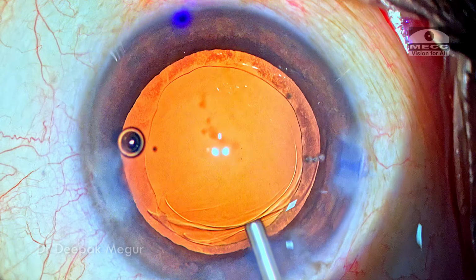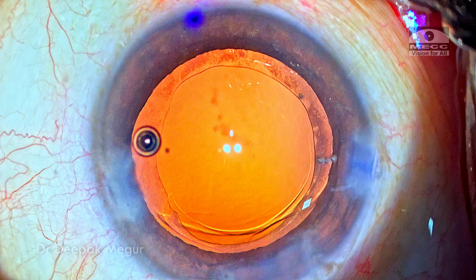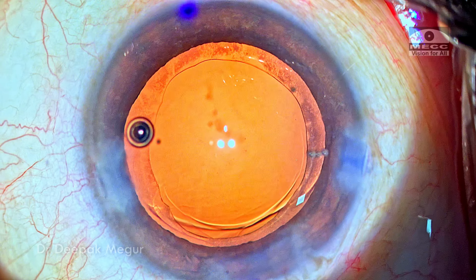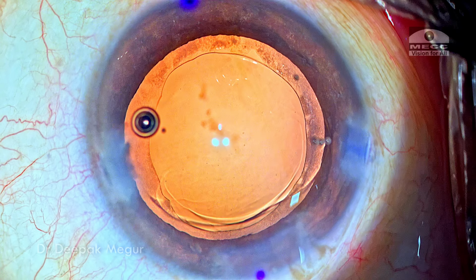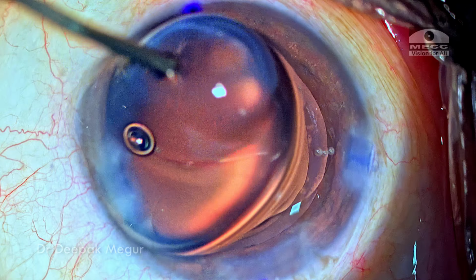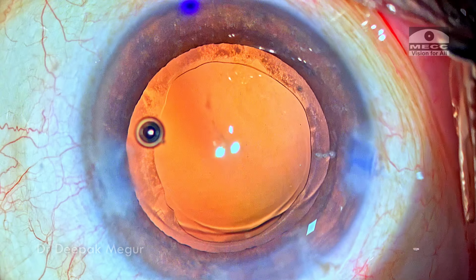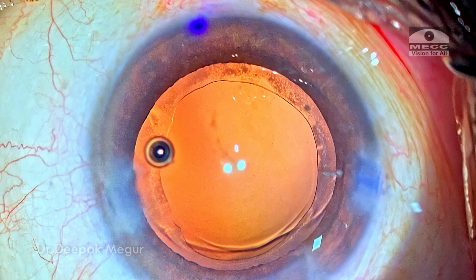small paracentral area where there still looks to be some fibrotic or calcified element, but I'm not going to touch it because I have planned a toric lens and I don't want a disruption in the posterior capsule. So I'll deal with that element later on, if at all it's going to have any visual consequences. So I was very clear about this aspect.